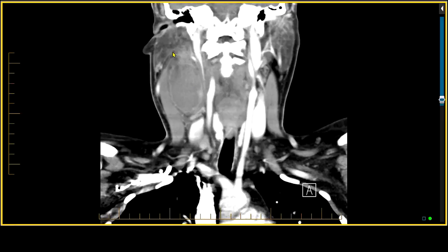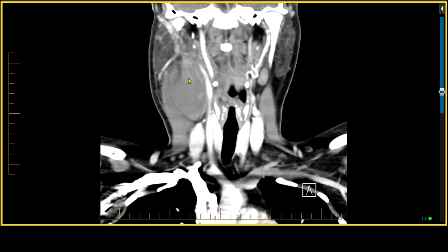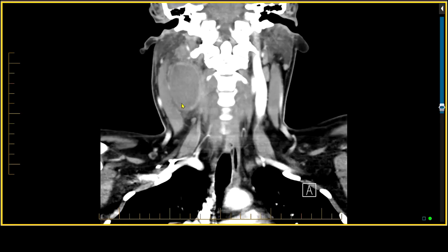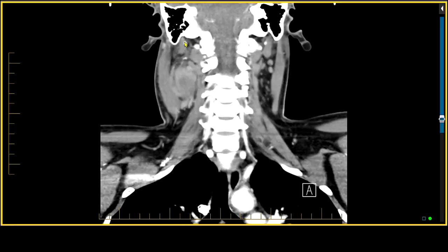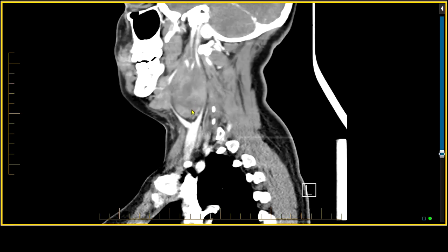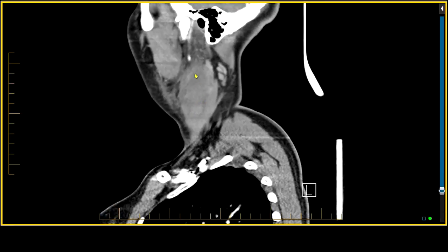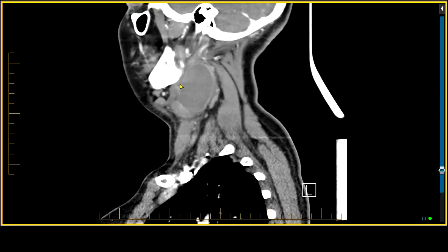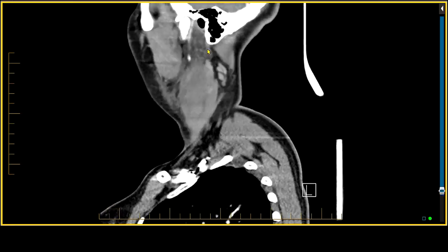Looking at the coronal and sagittal images, it is pretty easy to convince yourself that this is a lesion of the parotid gland given its close apposition. Here is the submandibular gland being displaced downward. We see haziness even to the sternocleidomastoid muscle and adjacent subcutaneous fat. As we move superiorly, we see tissue going right to the stylomastoid foramen. On the sagittal scan, we have this large mass in the parotid gland with irregular borders and subcutaneous fat infiltration, extending to the edge of the stylomastoid foramen.